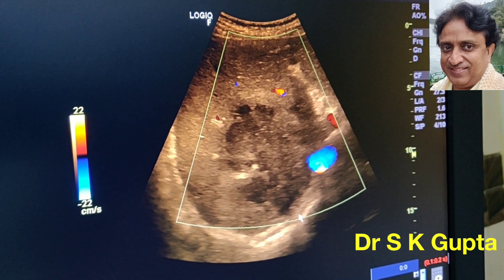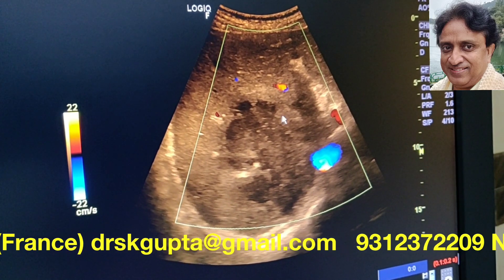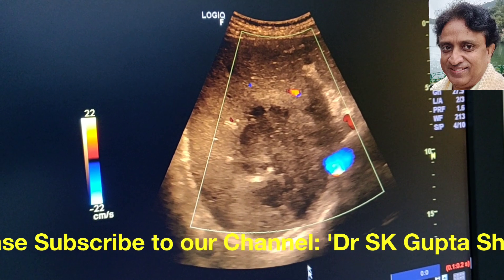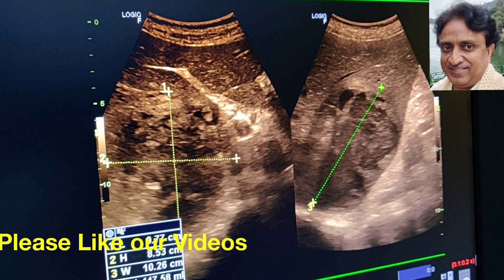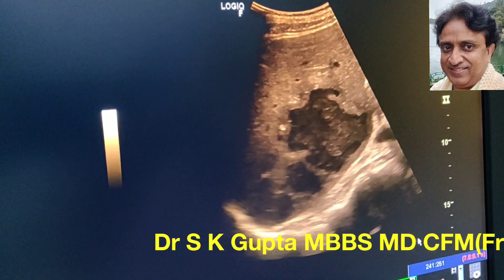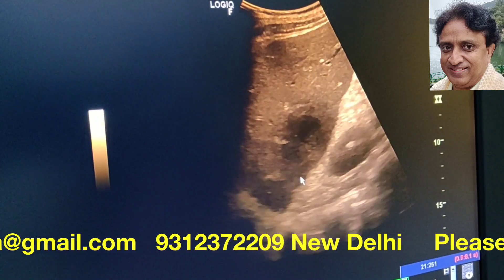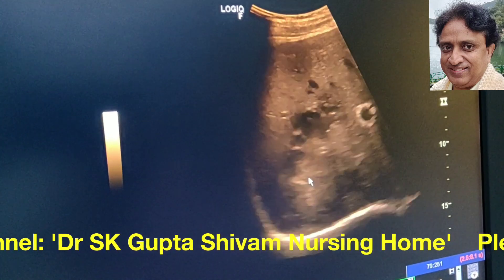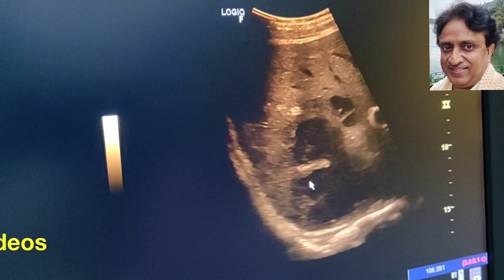Liver abscesses can have varying patterns, but remember they are generally seen in the posterior superior segment. Why the posterior superior segment? Because we tilt the probe posteriorly towards the back of the patient in the right hypochondrium to visualize it, and the probe is at the inferior part, so the superior part is at the back. Most commonly the abscess is here. Clinically, solid abscesses on treatment will liquefy and the size may initially increase before decreasing. The most important treatment parameter is clinical improvement — fever going down, patient feeling better, and pain decreasing.